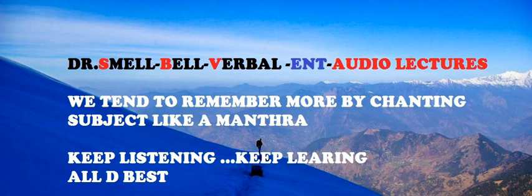Next, radical mastoidectomy. Radical mastoidectomy indications: extensive cholesteatoma and granulations eroding into the labyrinth. Procedure: the steps are similar to a modified open cavity mastoidectomy. The cochleariform process (CP) is fractured after cutting the tensor tympani. The middle ear mucosa is scraped. The Eustachian tube is blocked by first curetting the mucosa of the ET and tightly plugging it with periosteum and cartilage.